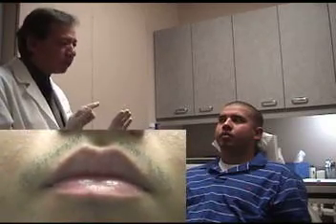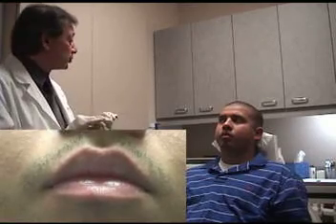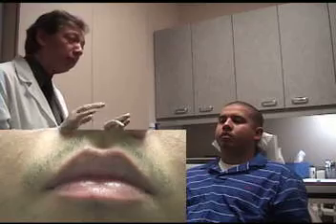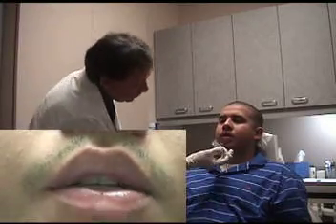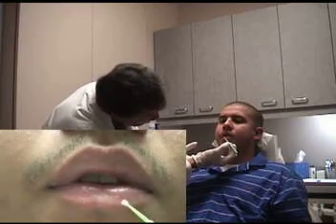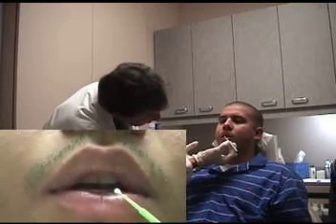Now I just want you to hold that position and not move thereafter, because we're going to place some impression material between your teeth, okay? So it's important you don't move at that point, okay? So I'm going to have you go ahead and start counting. 66, 67, 68, 69, 70, 71, 72.